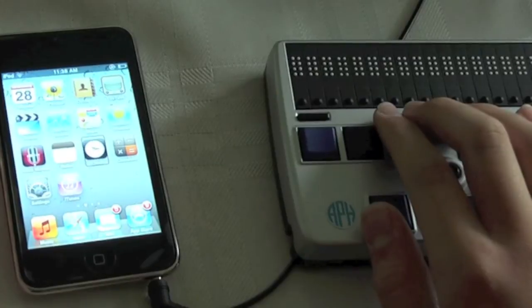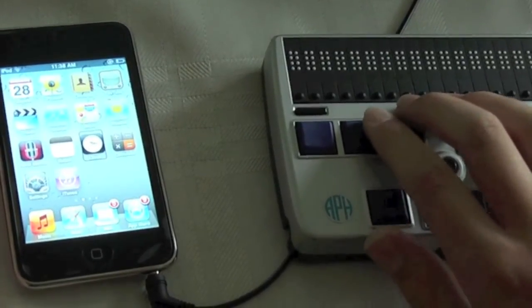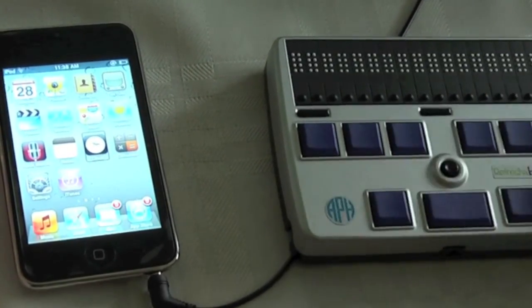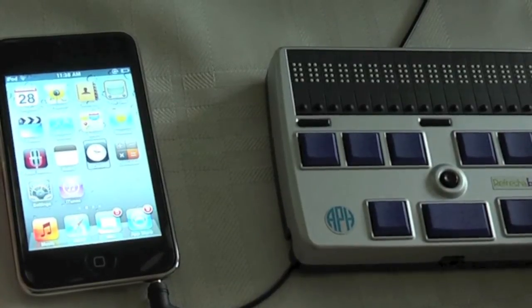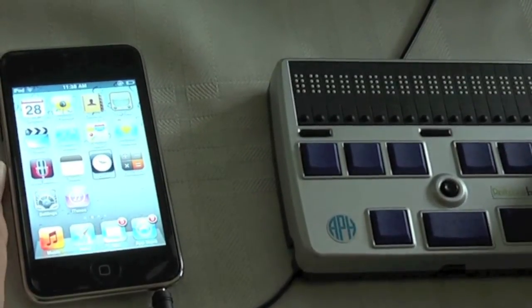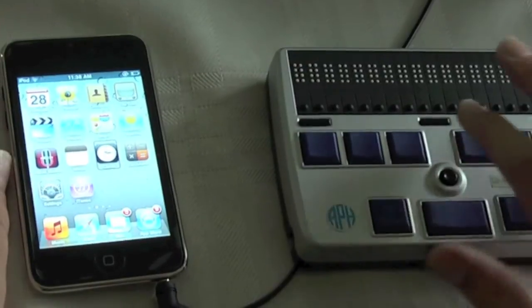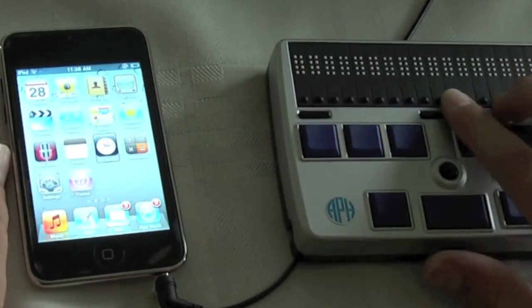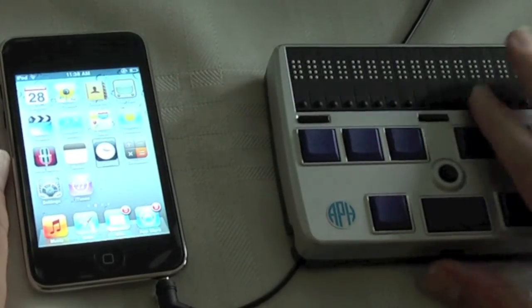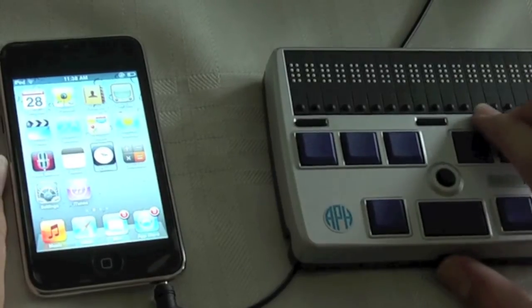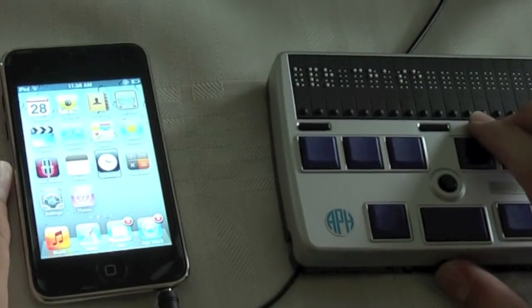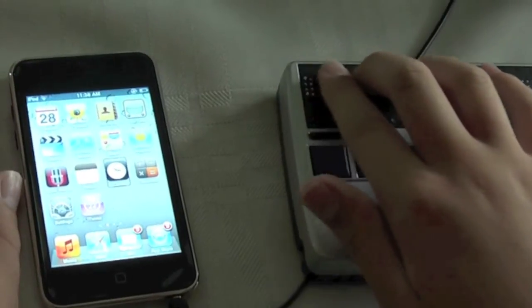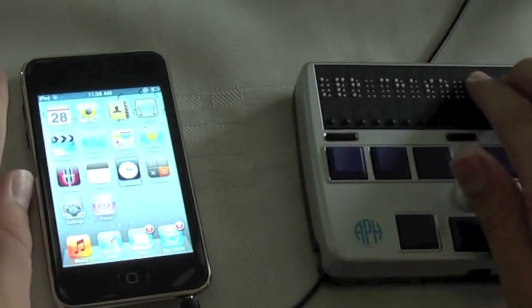As you might know, the Refresher Braille 18 can only connect with the iPod Touch or iPhone via Bluetooth as they do not have a USB port. I have an iPod Touch here which is already on, so what we need to do next is to turn the Refresher Braille on. I'll hold down the power button and you heard the cells vibrate and now we see my display's name.